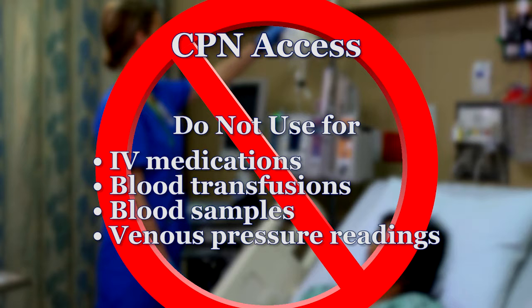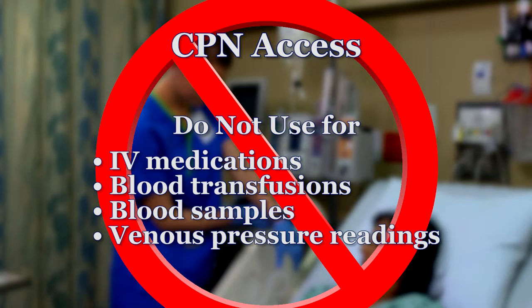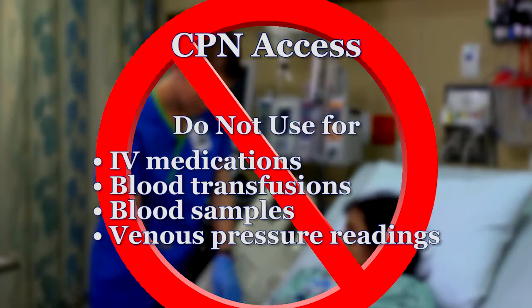CPN access is to be used only for that purpose. If the patient is to receive IV medications or blood, infuse them through a separate line or an alternative lumen. Use a different lumen or port to obtain blood samples and central venous pressure readings as well.